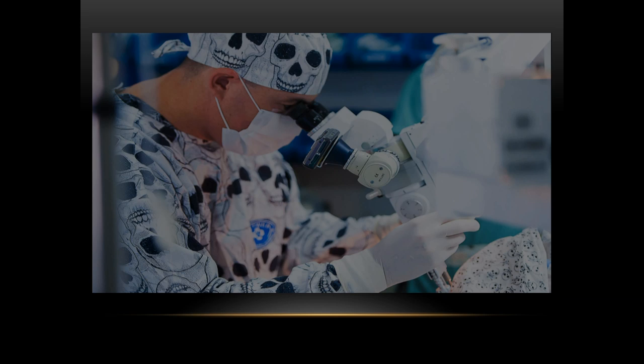Any questions about this procedure? So you should remove the endothelial and Descemet's membranes, because endothelial is the part that causes more rejection. We always have rejection in corneal transplant in dogs, okay? Some cases you have a very good transparency, and others you have a nice result, but you always have rejection.